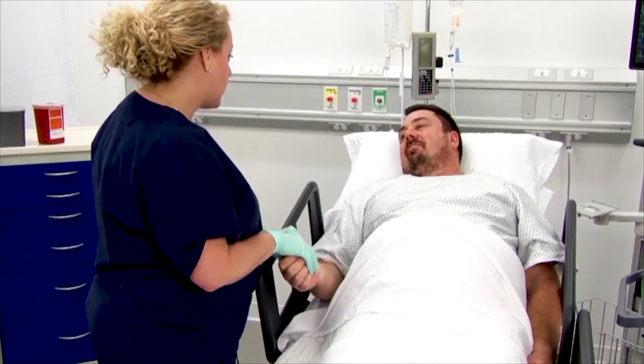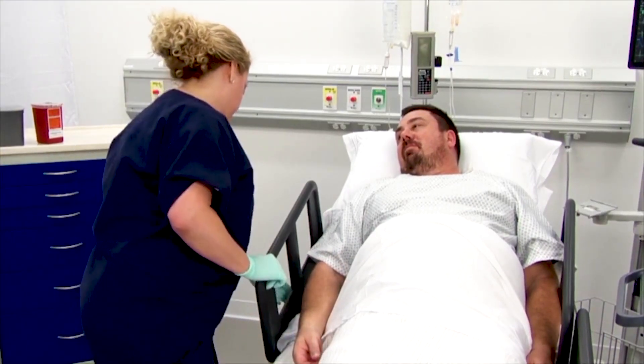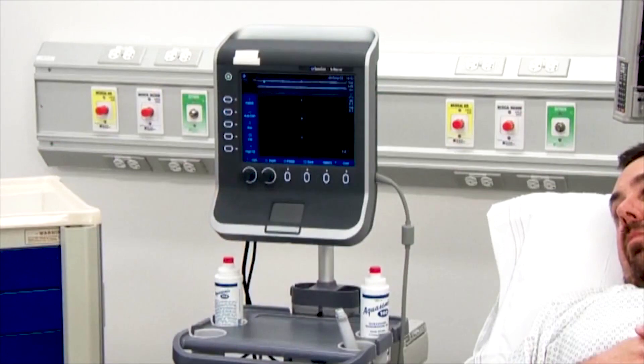To prepare for insertion, adjust the bed to the proper height and ensure that the ultrasound machine is in the proper position and easily accessible.